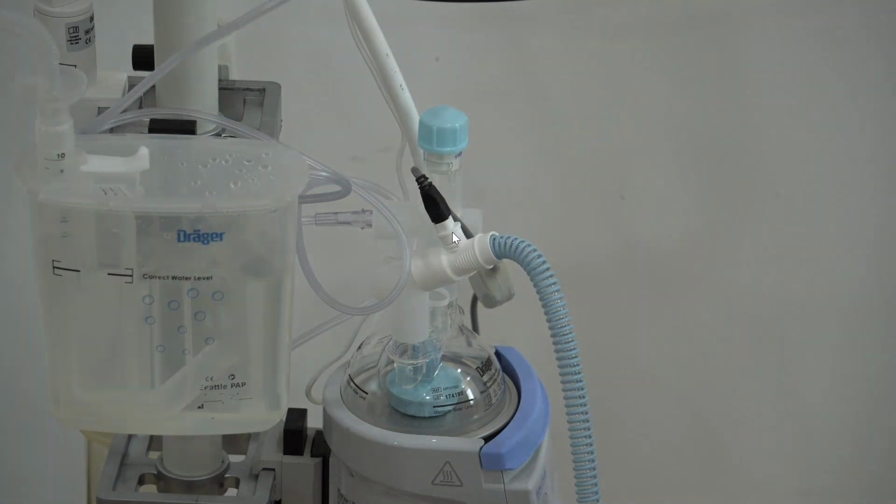Here we can really offer the CPAP therapy. We can only rely on the research that is available, and in the research setting, we saw that the delivery of the CPAP is very stable. It is stable throughout the time, and that's the only way we can monitor from the quantitative parameters.